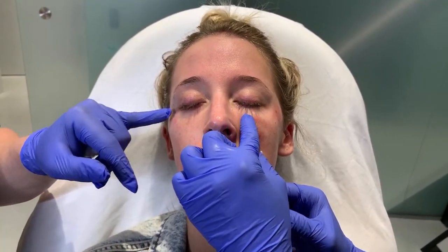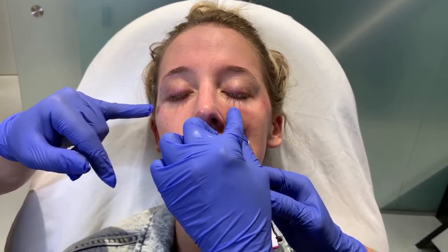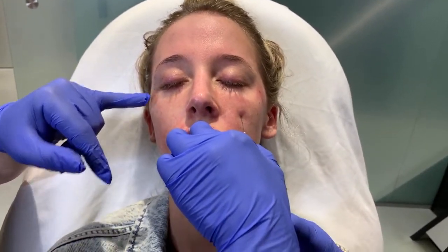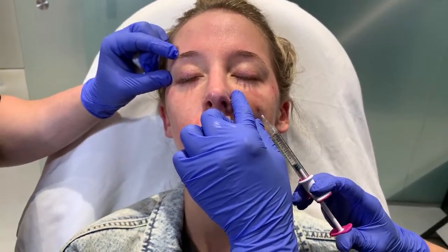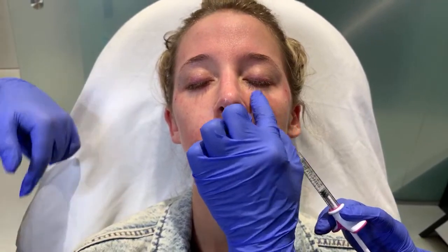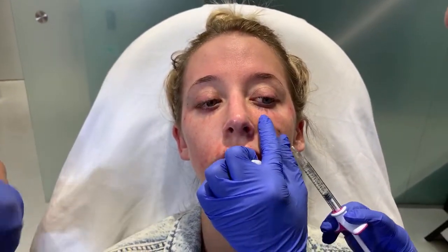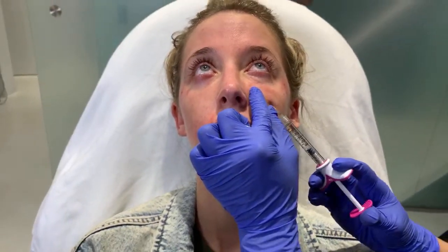As people age, they get a little indentation here, just like a hip dip. You can get it on the eye, so you get a little loss of volume here. Sometimes it's actually good to treat the trough and extend the filler up through here and into the orbit, so you can get a little lifting here and support into the cheek. And then you don't look as aged or hollow as you age.